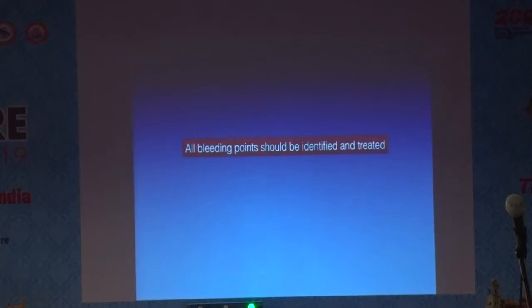And that's why I have a little bit of reservation regarding this sutureless sclerotomy, because I like the pressure to be a little on the higher side. And I found that I don't get that pressure when I use these self-sealing sclerotomies.